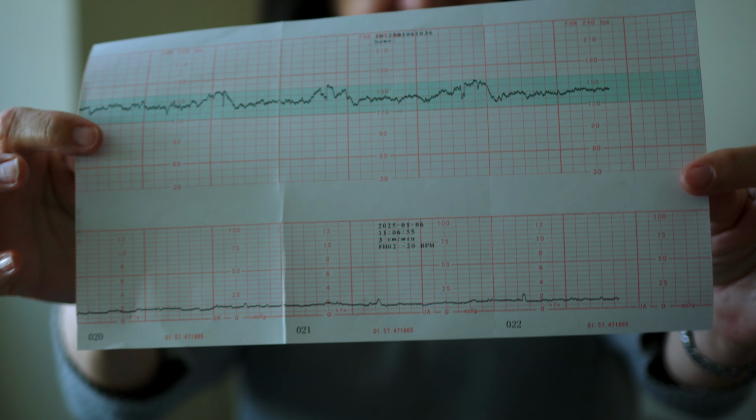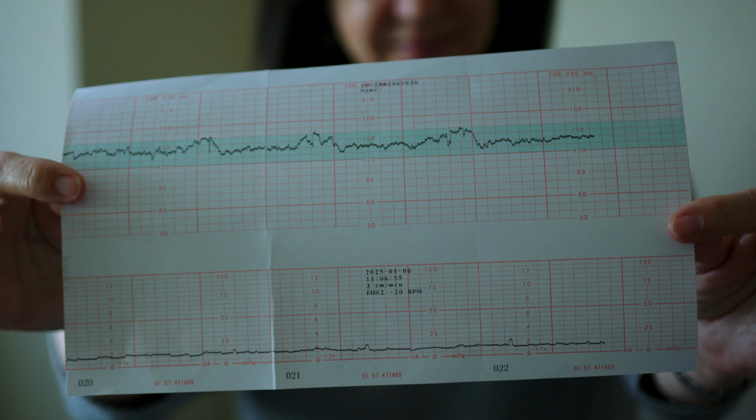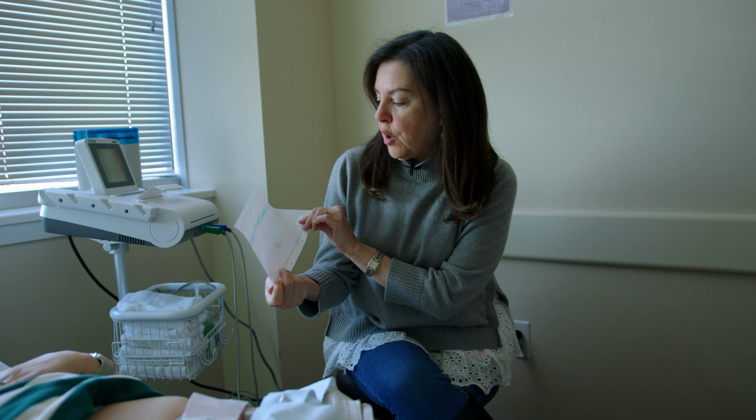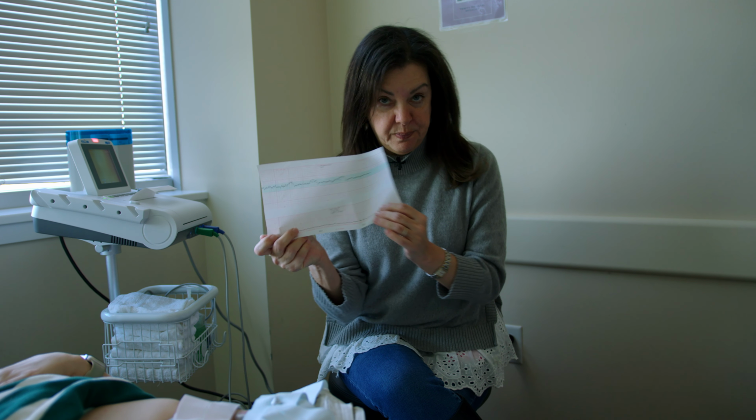And when we're looking at the tracing, what we want to know is what's the baby's baseline heartbeat. And this baby looks like the heart rate's in about the 140s. And there's a little bit of up and down motion called variability. We should see that for every baby. It shouldn't just be a flat line.